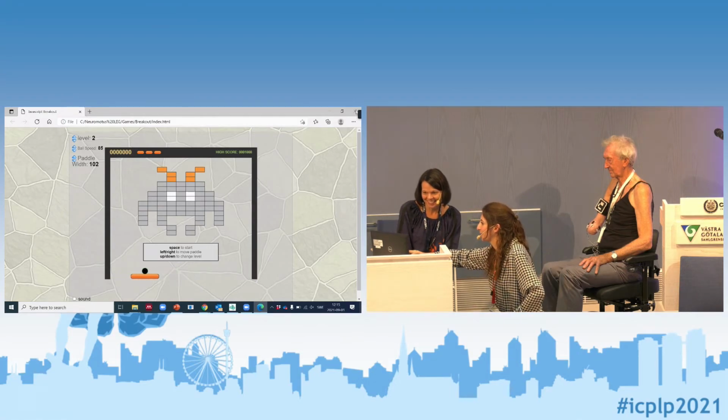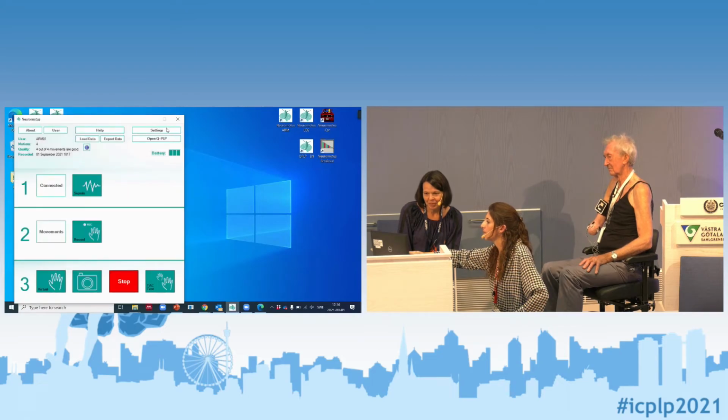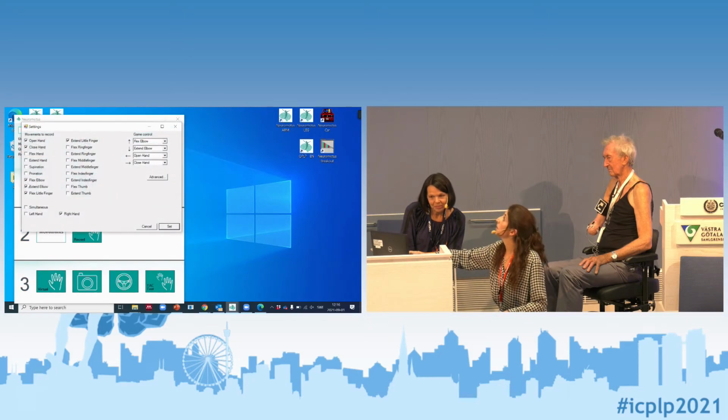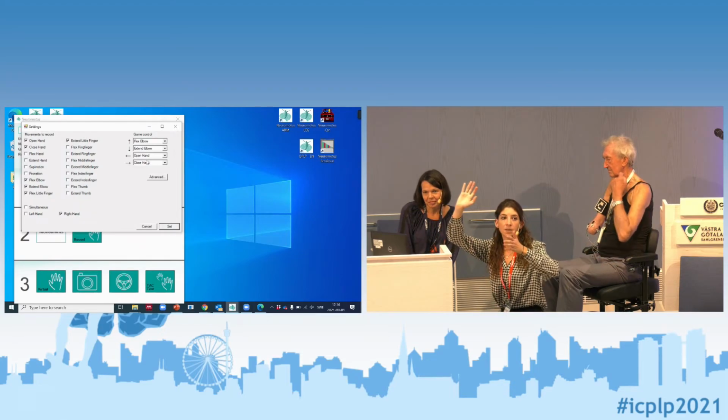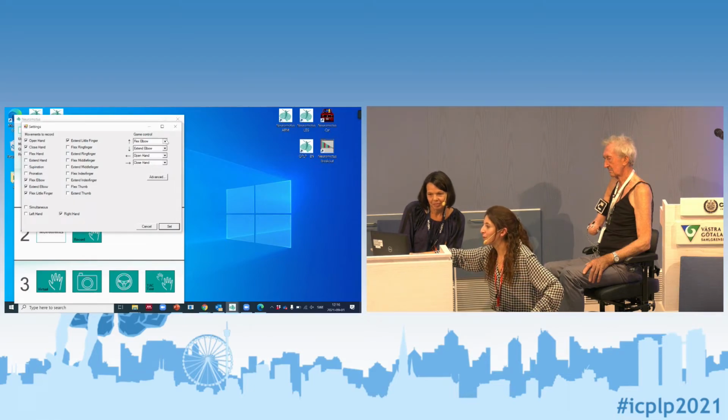I will just stop this one, 2 seconds. So in the software here you have settings. I will stop this one. So the idea is that you remember here we have the movements that we record, and also here you have the different movements that you can select, the different directions where you want to control the game. So I will just remove. Wait. I will remove this one because if not, he will have control of my computer. I don't want that this time.